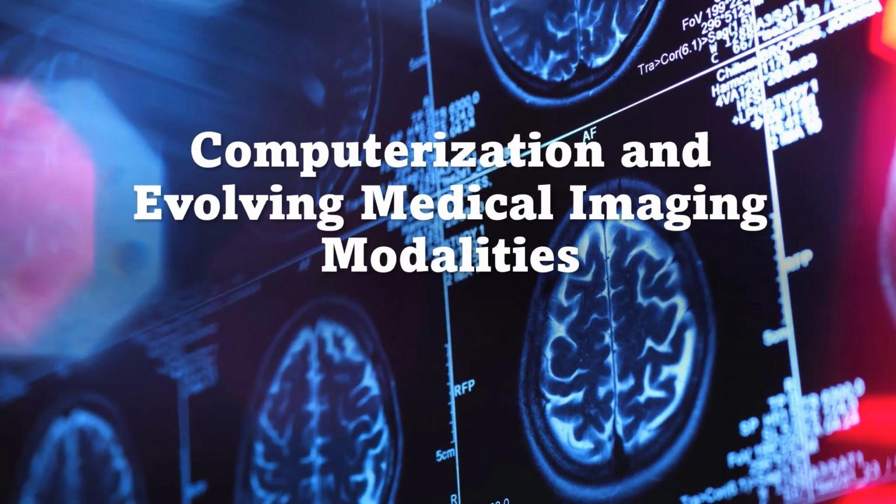So let's take a look at how computerization and automation contribute to errors in medical imaging. With the photographic process of medical imaging that we used to use in film screen, you would find an error and then have to analyze how that error occurred, which was usually obvious. With digital, the errors are not so obvious, and sometimes we miss their occurrence. It is much harder to do quality control on digital imaging than it was with film screen imaging.